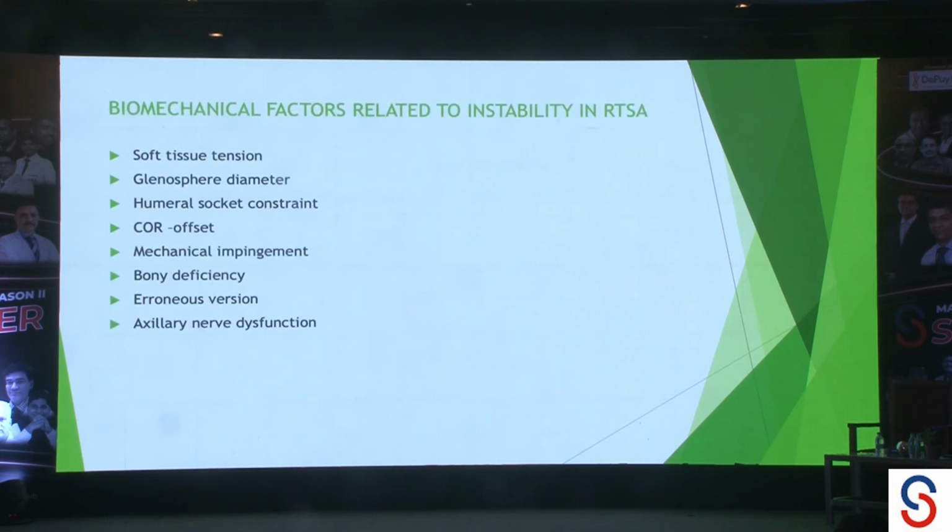And there are all these biomechanical factors which also contribute to the instability. If soft tissue tension is not adequate, glenosphere diameter is also an important factor. These factors have already been discussed in detail, so I won't go into much detail on this.